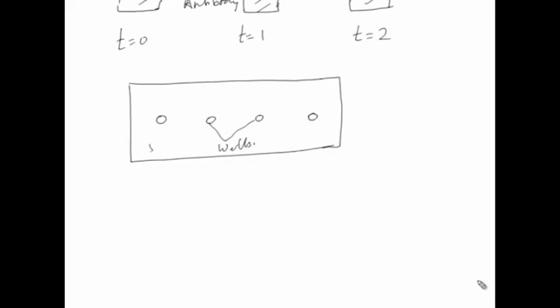Different concentrations, say 50, 100, 150, 200, increasing concentrations of antigen, are loaded in here to see the effect. There will be radial diffusion in all directions from all the wells once you have loaded the sample. It is simple diffusion, since only antigen is moving, and the antibody is contained in the agar, which is put in here.